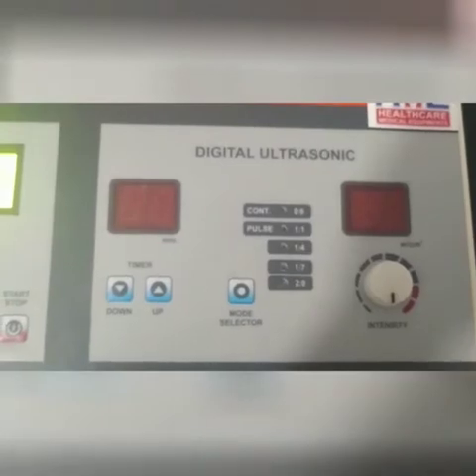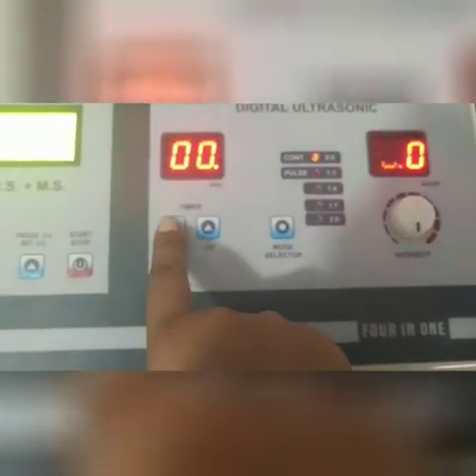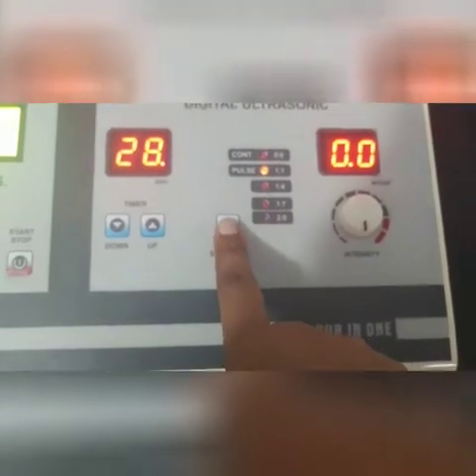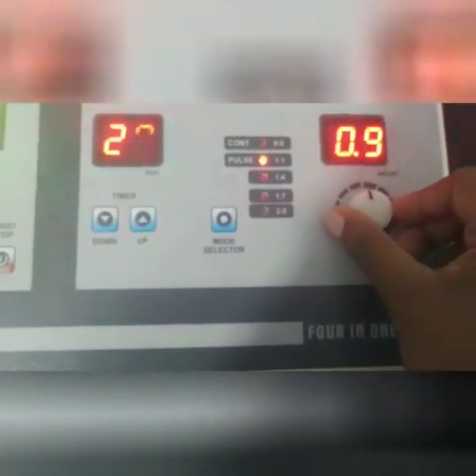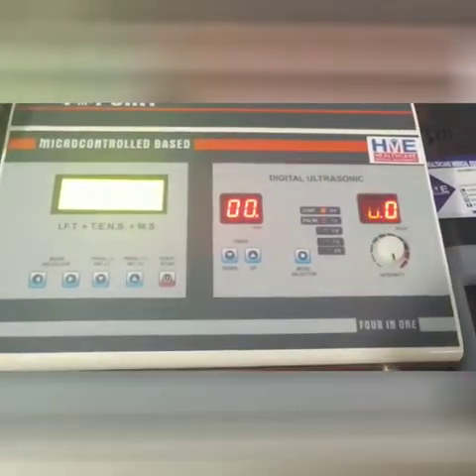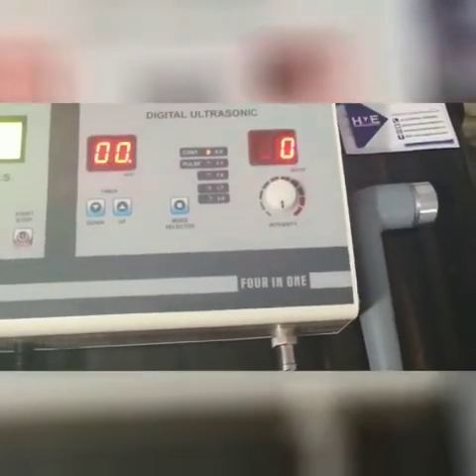The machine has been started, as you can see. This side is for ultrasonic — I have started this one also. I can increase the time from here; now it will go to 99. I can select the mode as well. I have put the electrodes and the ultrasonic probe on, and now I am going to show you how to use it.